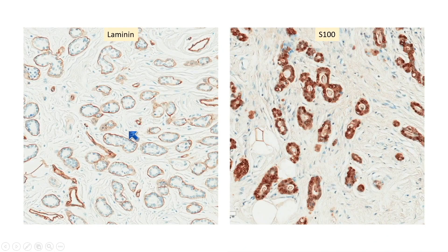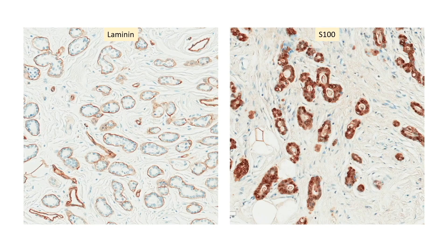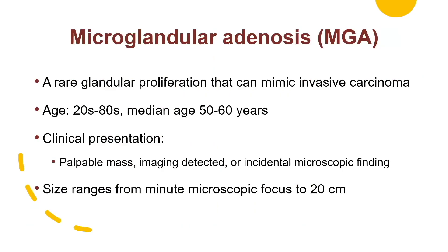The glands are surrounded by basement membrane, highlighted by immunohistochemistry for laminin and collagen IV. This is the laminin stain. S100 is positive. With this information, the diagnosis is microglandular adenosis, or MGA — a rare glandular proliferation that can mimic invasive carcinoma.